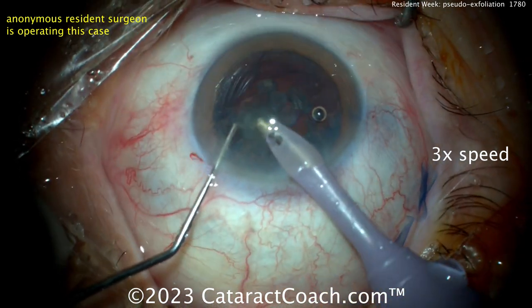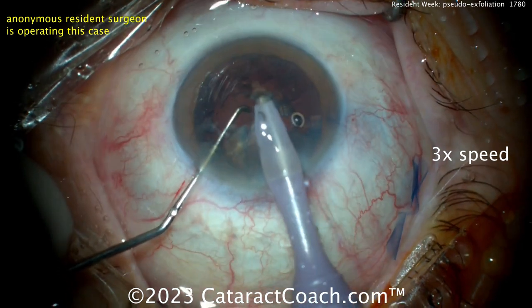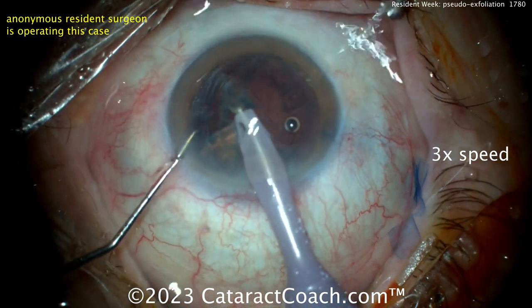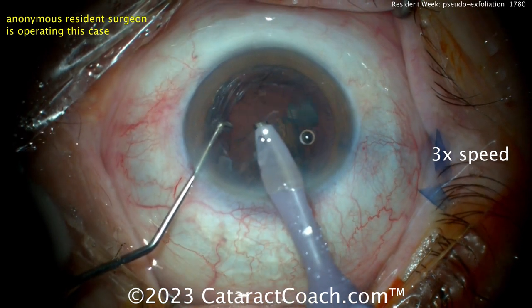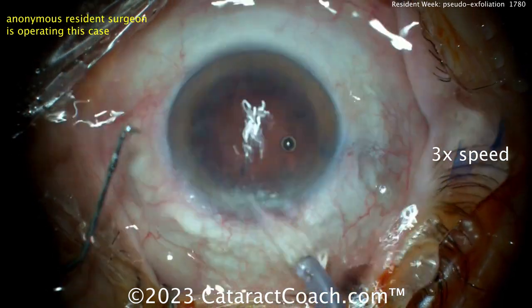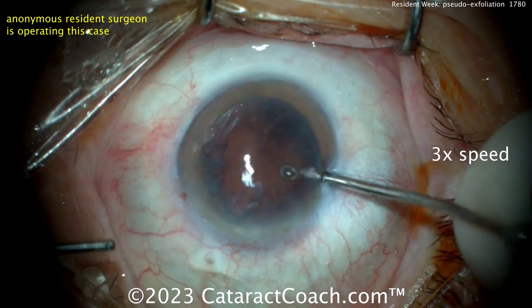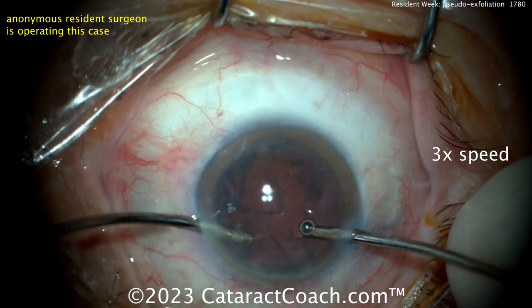Between the phaco probe and the chopper there's a big chunk of nucleus — you want to bring that forward. But look how much is underneath the phaco probe — it's subincisional. You have the whole half that's subincisional, so let's get that rotated around and pushed forward. Don't go digging in the bag — that's high risk. Grab those quadrants and bring them up; you don't have to chase the tiny little pieces. You can actually twist the phaco probe in your hand a little bit — that'll change the fluid dynamics within the eye and cause the pieces to come to you. You don't want to go fishing around, especially for tiny little pieces that are very close to the lens capsule bag.